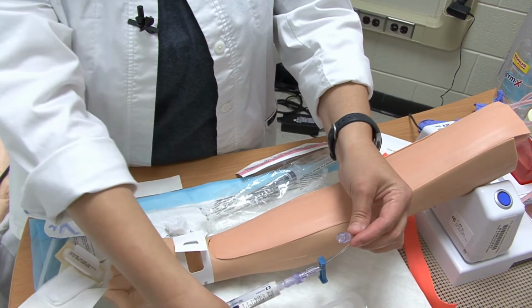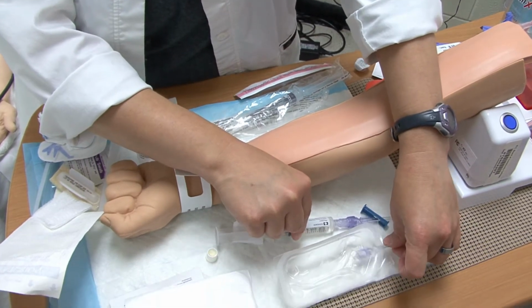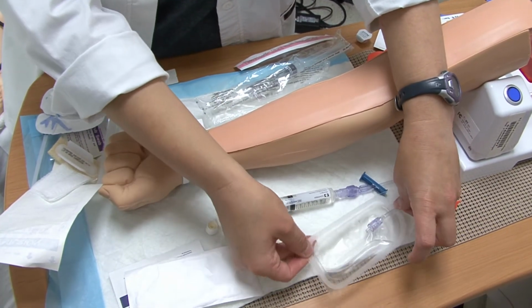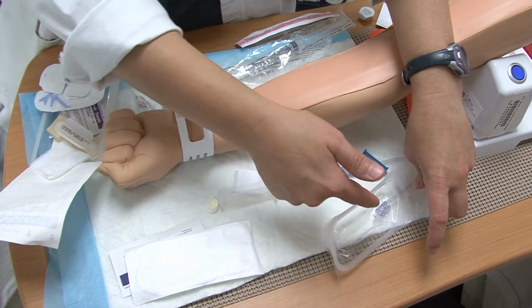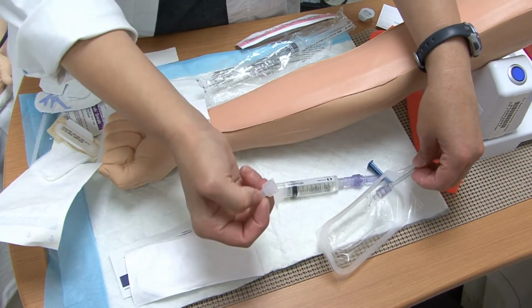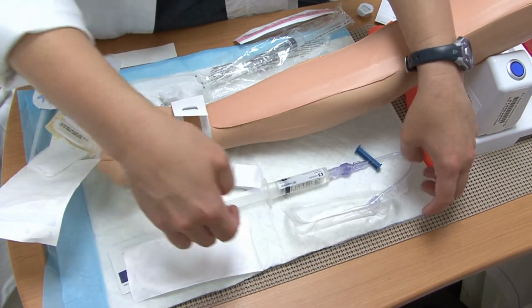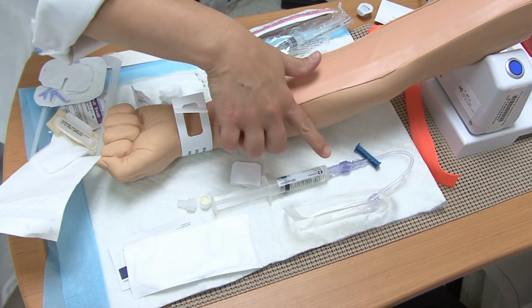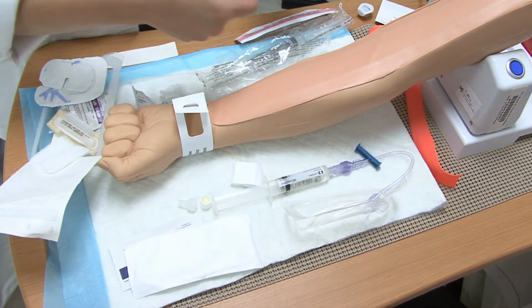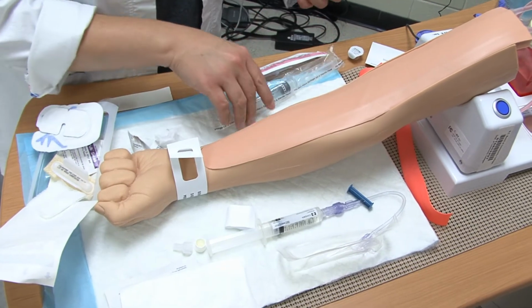Now, since I have not touched anything inside of my package and it's still sterile, then I can actually put the end right here in the package, and it's keeping that end sterile. If you feel more comfortable with putting the cap back on it, then you can certainly do that if you're worried about the sterility of the actual extension set. I like to do this because it makes it easier when I pick it up to attach it, and I'm not having blood kind of go all over the patient.